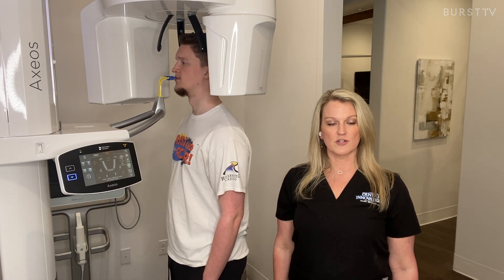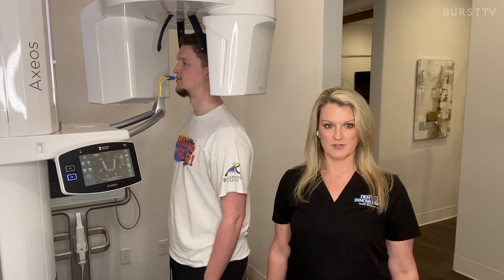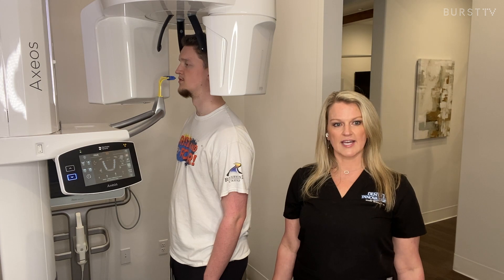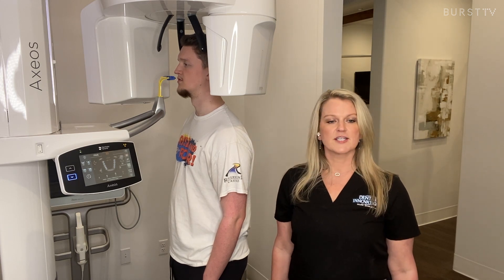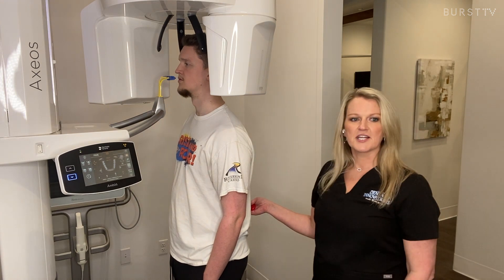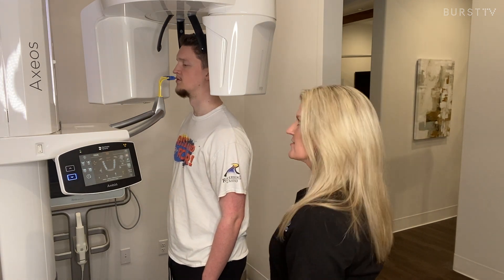The CBCT scan uses a lower dose of radiation than a regular CT scan. No radiation will remain in the patient's body once the scan is complete. So today I'm going to expose a 3D image for us to view, so I'll just have my patient step into the machine here and then I'll show you how to do this.